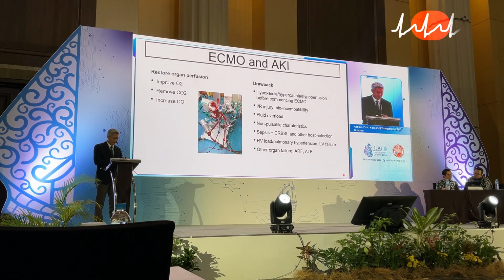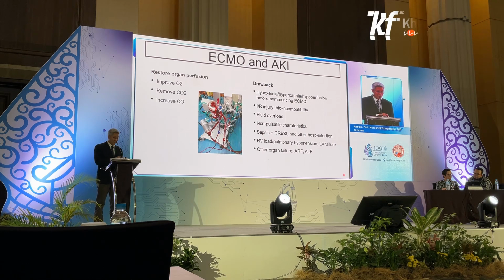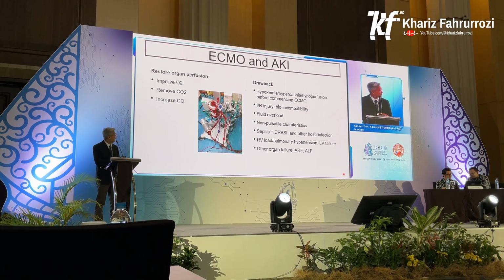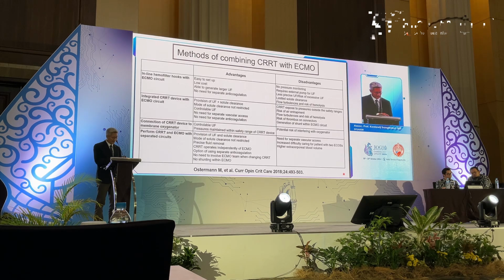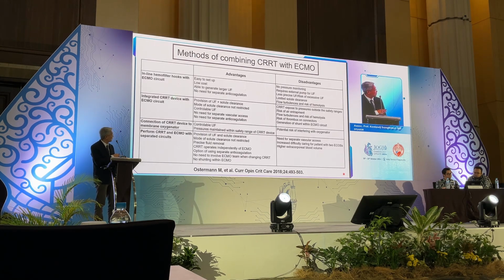Another option for CRRT: I think everyone also has experience with ECMO, right? To improve oxygenation and improve cardiac output. But ECMO usually causes AKI. CRRT seems to be one option for this population as well, but right now we do not have complete evidence on which strategy is the best way when performed. These are the methods to combine CRRT with ECMO.